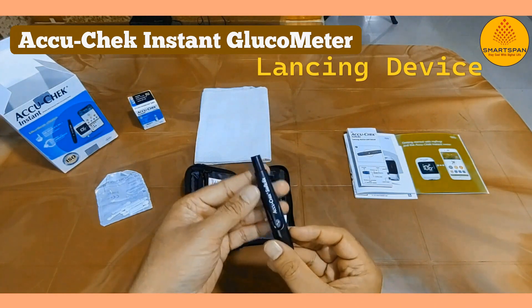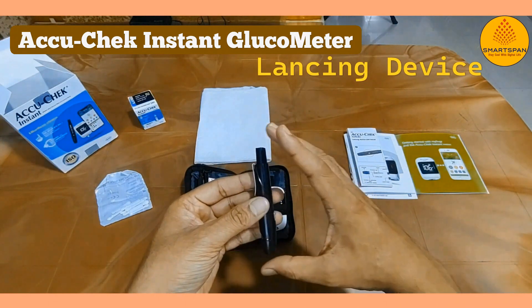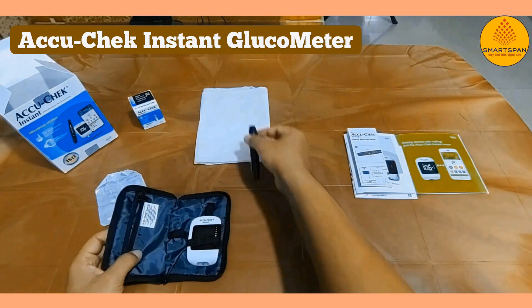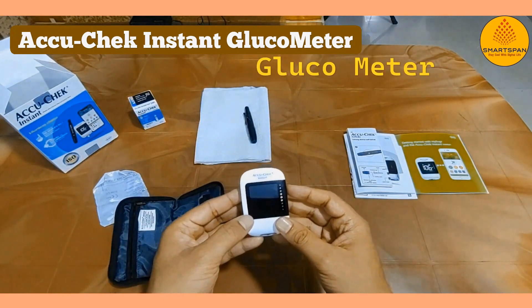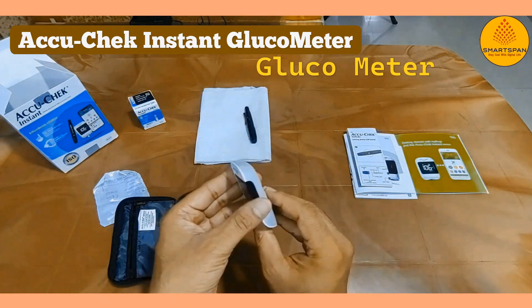Next we have the lancing device, which is used to obtain a tiny blood sample for testing. And finally, the glucometer device itself — sleek and compact, designed for easy handling and accurate readings.